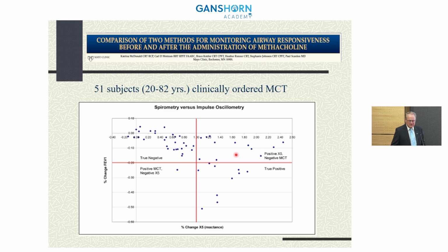So is this cohort of individuals those that are affected by the deep breath maneuver that you still have to perform in order to do spirometry versus normal quiet breathing that you have when you're doing an oscillometry measurement itself?